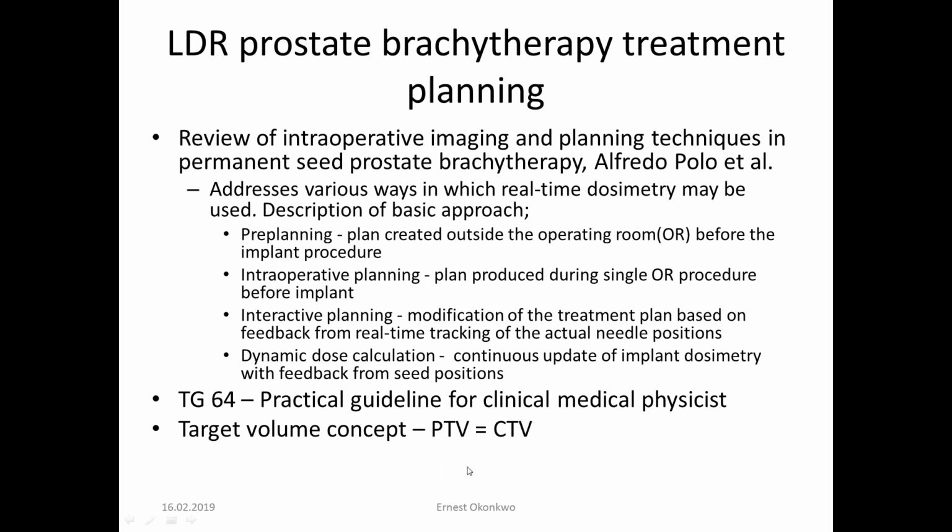For our clinic, our PTV is equal to our CTV. We don't add margin to our CTV. Many clinics do add margin to their CTV.